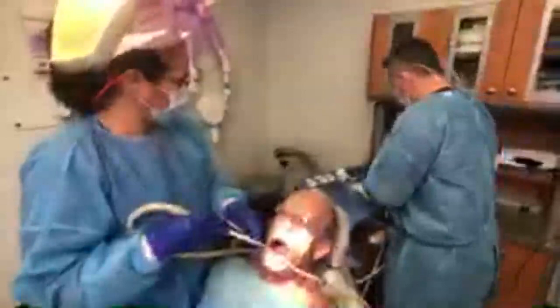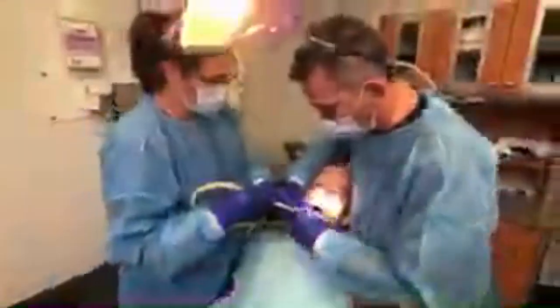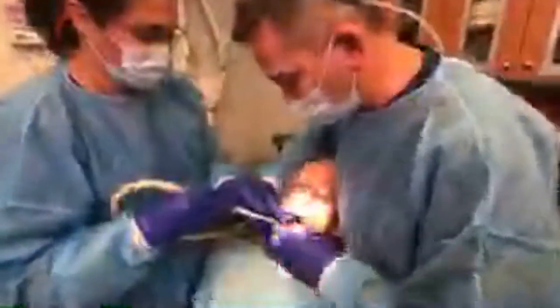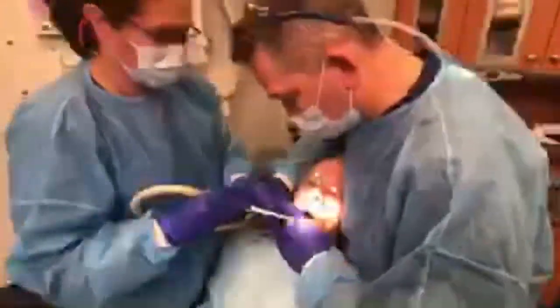It just drills right into the hole. I'm going to place it like so and then use this ratchet for the final torquing and placement. His bone is fantastic, but he does have that concavity to be careful about. And that's it — that's the dental implant placed.